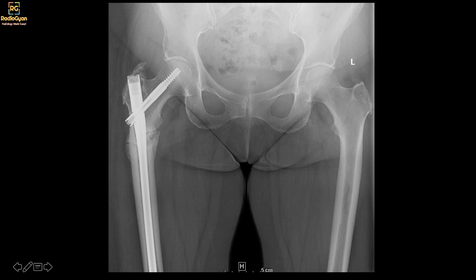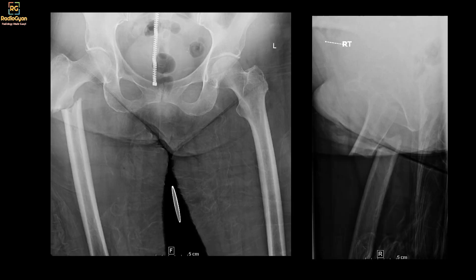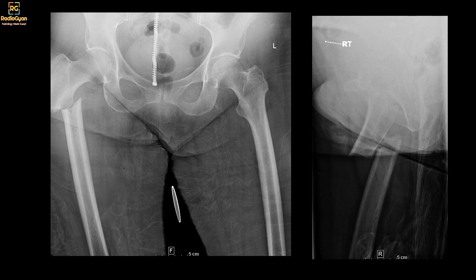What I did was I just had a look at the prior. This was the initial radiograph when she had presented a year ago. And if you can see here, this is an odd location for a fracture. It's a transverse subtrochanteric fracture. Usually osteoporotic femoral fractures are around the femoral neck — either intertrochanteric or subcapital. But this is an odd location for a femoral fracture.